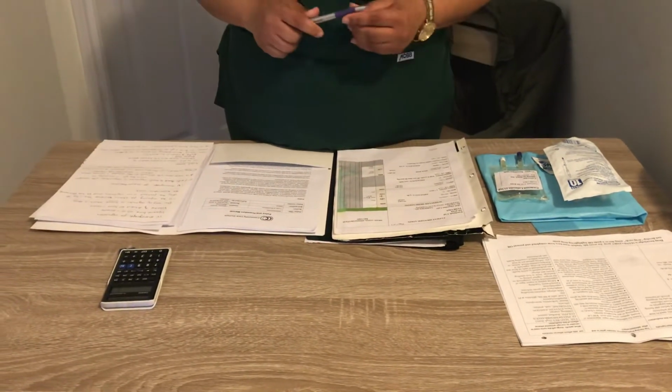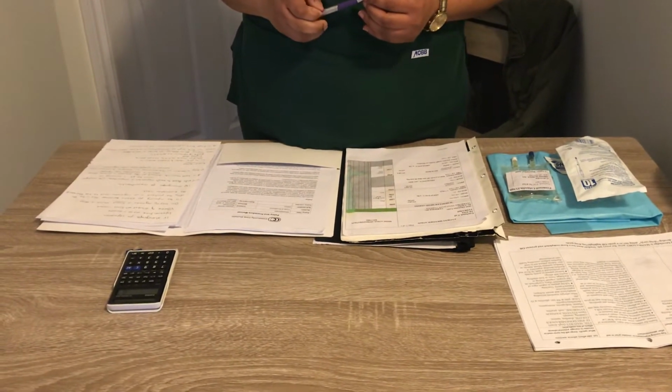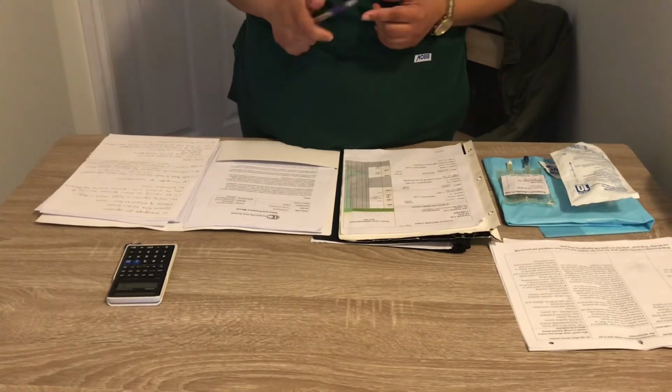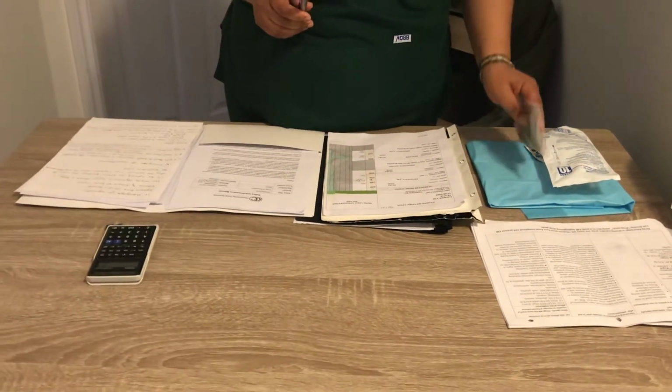I'm going to use my nursing judgment, and I'm going to be infusing for 25 minutes because this is the second day the patient is on cefazolin and he has tolerated the medication well so far. The rate is not too fast and it's not too slow. The volume of diluent of cefazolin is 50 ml to 100 ml. Our bag is 50 ml, which is okay.